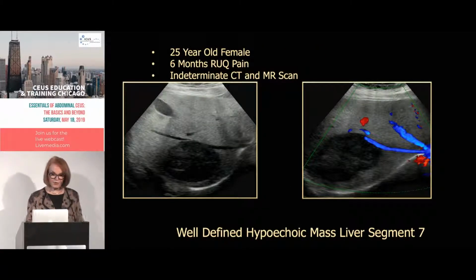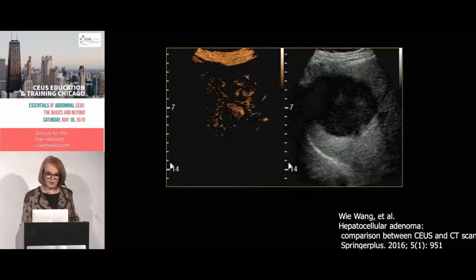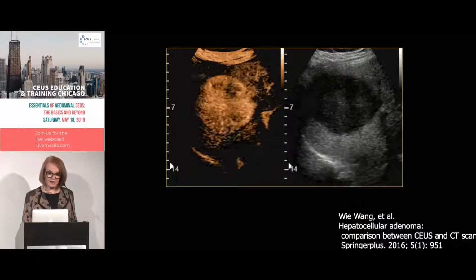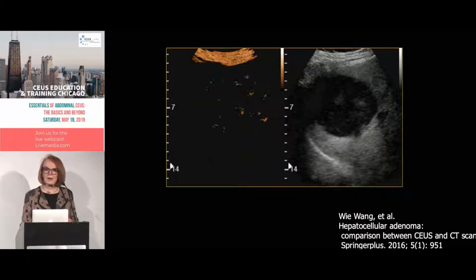So let's look at another patient, a 25-year-old female with a very fatty liver and right upper quadrant pain. So that mass is a big and black mass, and it's in a big and white liver. So the liver looks concerning, the mass looks concerning. So we're worried about this anyways. So when we inject the contrast, you can see this is not a hemangioma. This is not an FNH. And so it's got a rather disorganized kind of enhancement. And so that could be an adenoma.